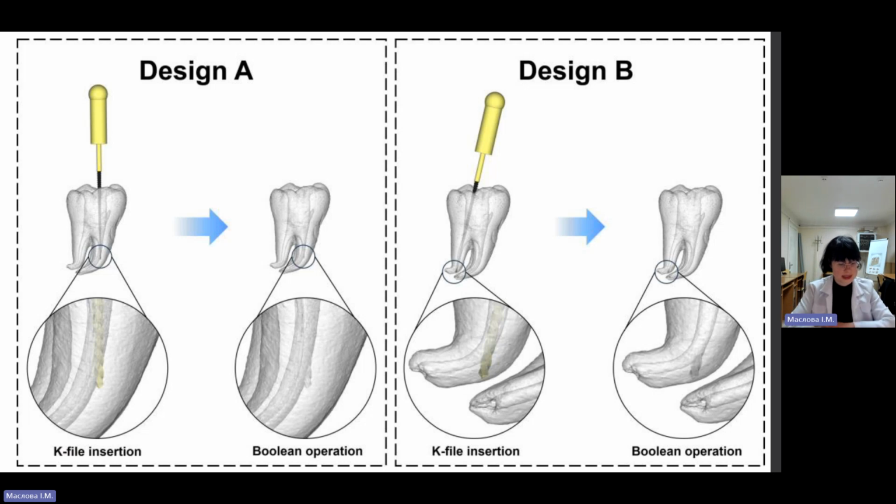The most common mistake is an access opening that has been made too small. As a result, canals are missed, or the manipulation of the root canal instruments is unnecessarily hindered, with pulp horns unnecessarily hidden by the cavity walls.